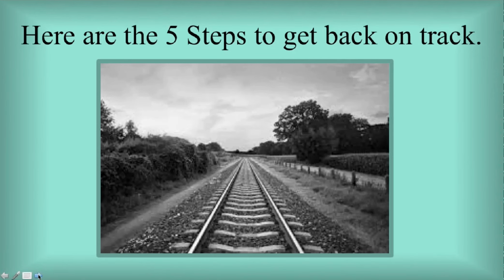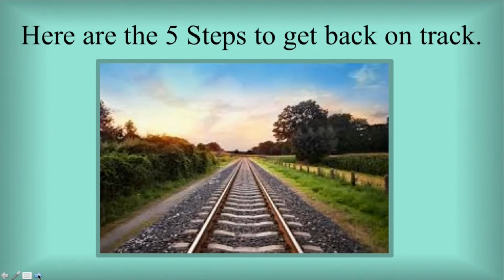Okay, so I'm going to show you the 5 steps to get you back on track once you discover at some point that you've produced an open bite. Now, the longer you go and the more you see this through your eyes, the less you'll let it get severe, because you'll see it happening from the early stages. That's one of the reasons you have the patient come in every 6 weeks or so: to identify what's going on, to check the posterior bite, and to make sure that the movements are taking place the way they're supposed to go.